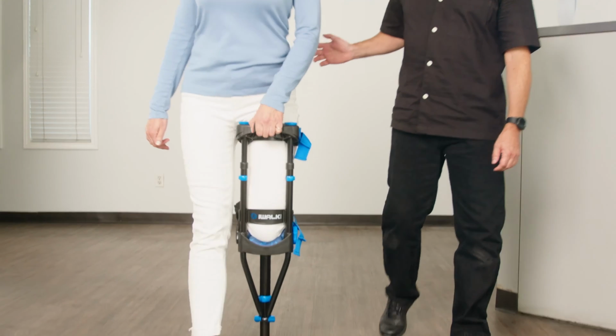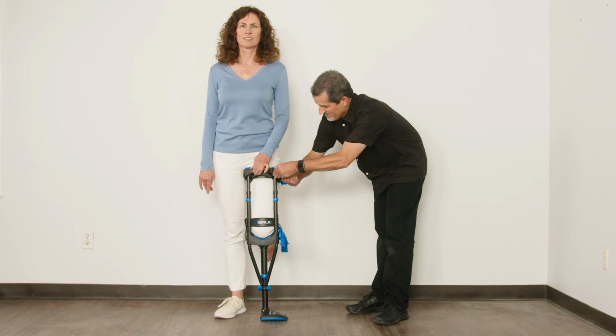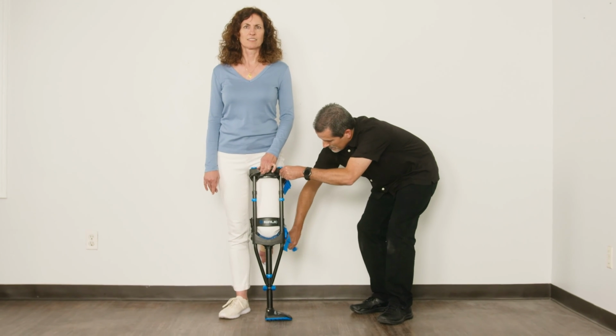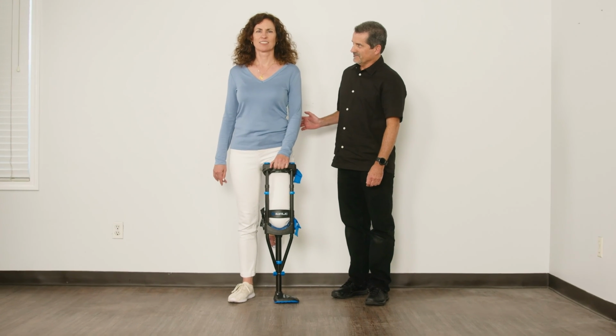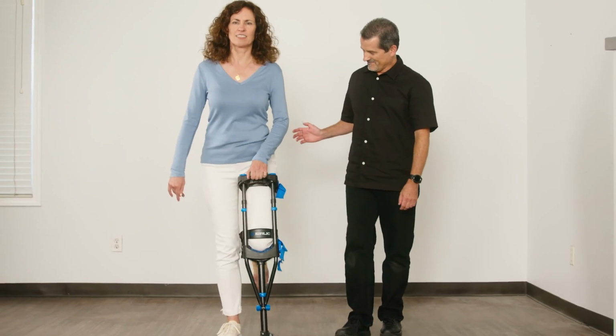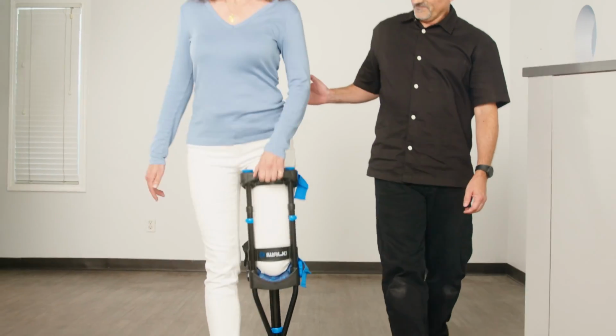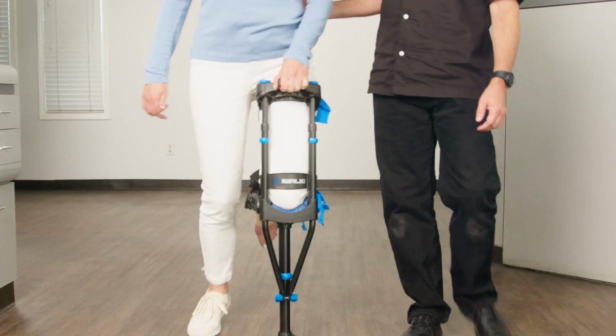Stopping and starting makes it harder to learn. Check the strap tension and retighten if necessary. If they are off balance or have a tendency to lean back, a gentle force on their upper back using only your fingertips is all that is needed. Avoid over-assisting them. This will slow down their learning. Even if their first steps are awkward, most patients will automatically adjust to smooth their gait.